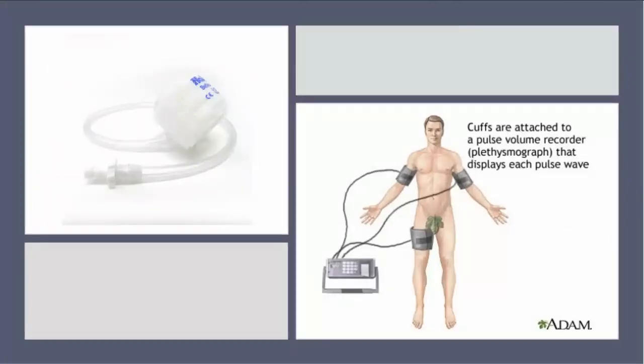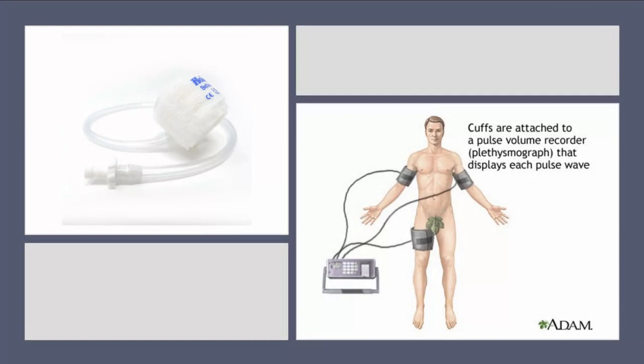And here is our sensor that we would have for this associated exam. And then we would move the cuff up to the thigh if we were really doing a Doppler segmental of the common femoral, but usually we're just going to do an ABI for them and then compare with the PPG reading.